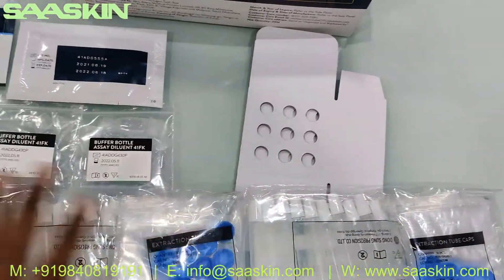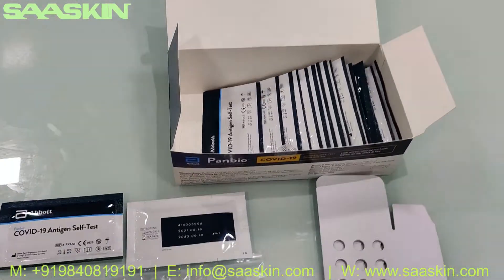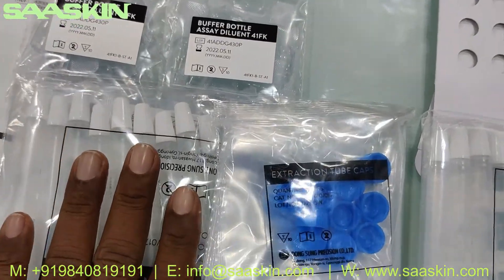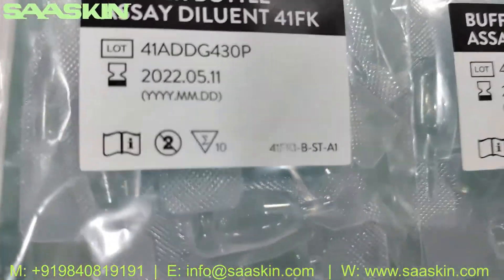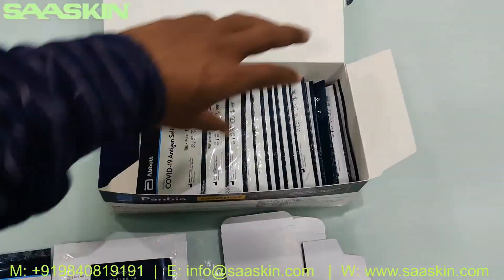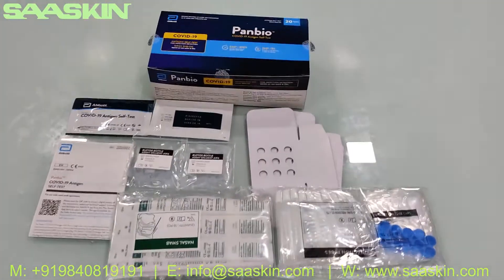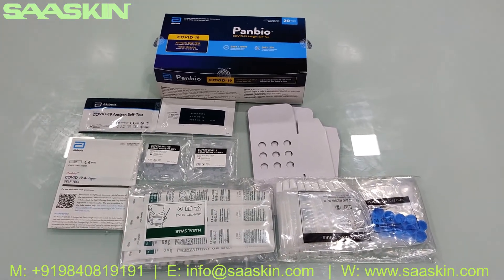To quickly summarize: the 20 test kit pack of the Panbio COVID-19 Antigen Self-Test contains 20 test cassettes, two paper stands, two packs of 10 extraction tubes with caps and swab sticks, two packs of 10 dilution buffer bottles, and one IFU brochure. This is the complete kit. Thank you.